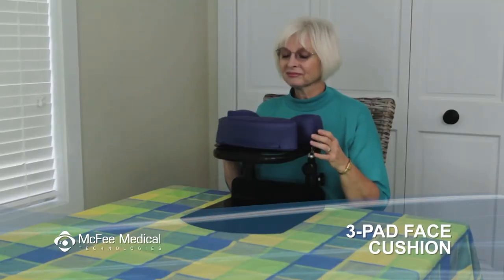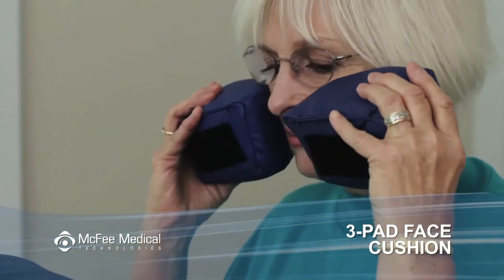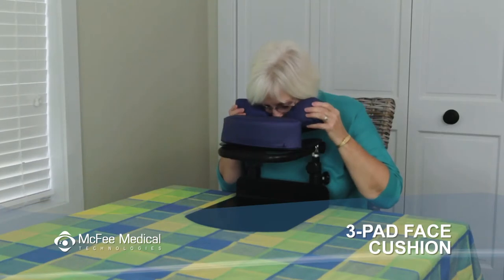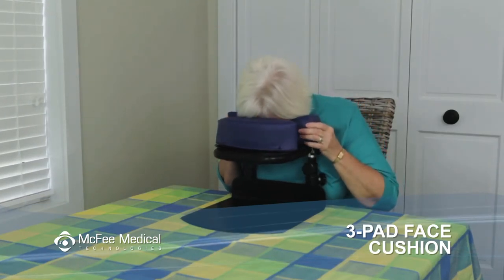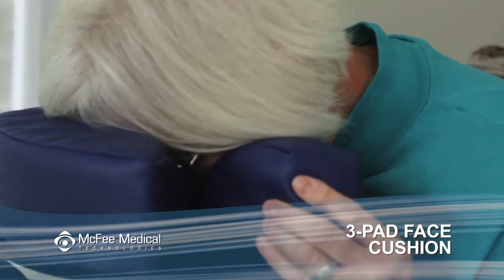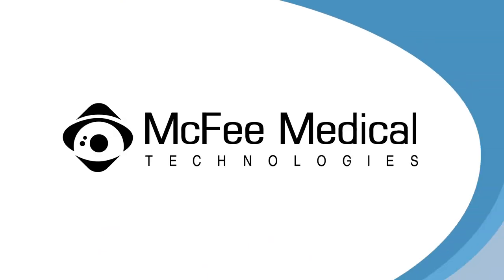Remove the two cheek pads and hold them up to your face while wearing your glasses or eye patch, in a position where they do not interfere. Lean over the face rest platform and settle the two cheek pads in place until the cushions are in contact with the velcro on the face plate. Note that the face rest cushion should be angled down slightly so you're looking down at the mattress. We also suggest using a bed sheet or bath towel to cover the torso cushion.